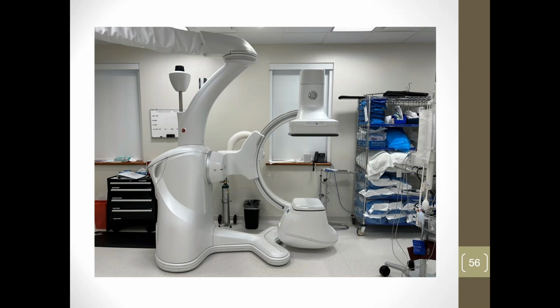One thing that makes a hybrid OR nice, and the fact that it is in the OR, is that you can most of the time move the system out of the way. So here you see the robot all on its own. If you wanted to use the room for conventional surgery, you could, just park this out of the way and do your surgery in there. Or if you needed to do imaging, then your image machine's just right there. You just grab it, get the remote and park it by the patient, and you can do all your imaging stuff.